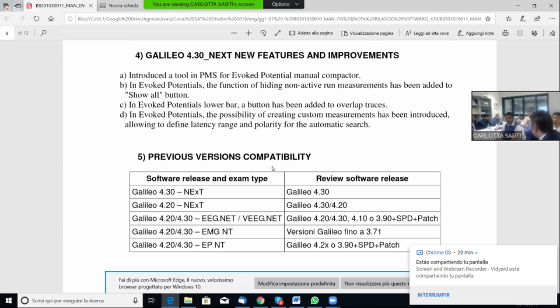It's a compacted feature that deletes all the raw data and maintains only the filtered examination. It means that you can't modify this examination. When you create this compacted file, you can't modify the filter. You modify the filter inside your bandwidth, not the whole examination. Can we re-average? Yeah.